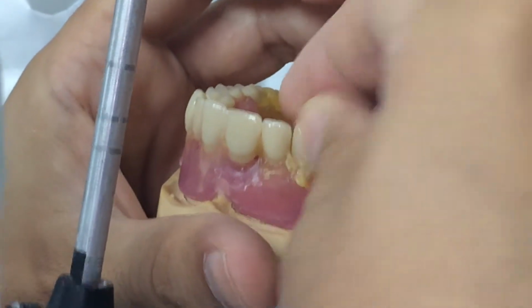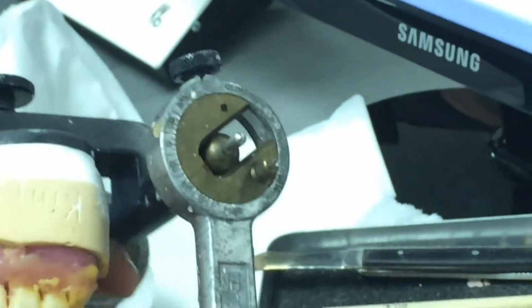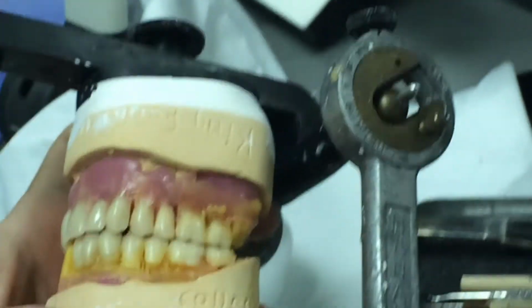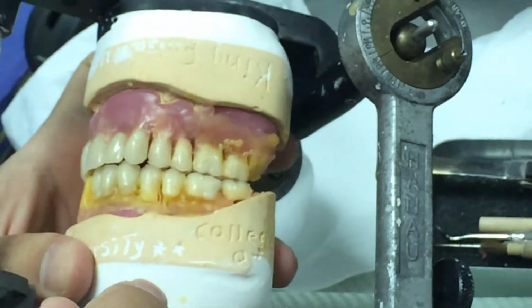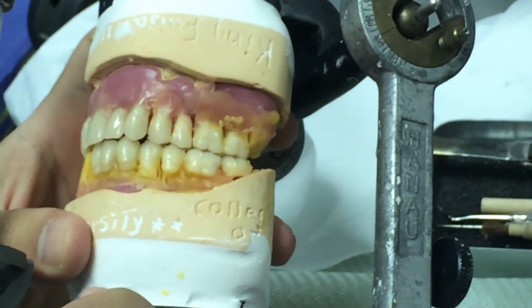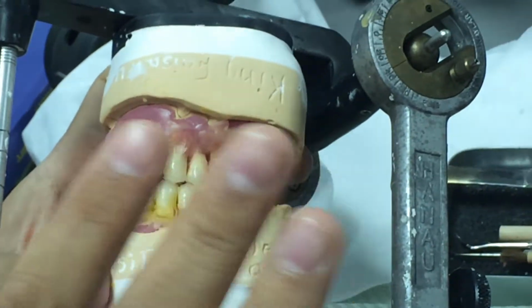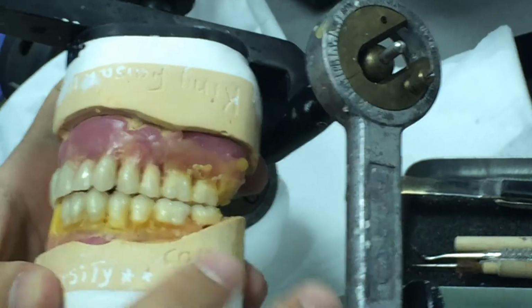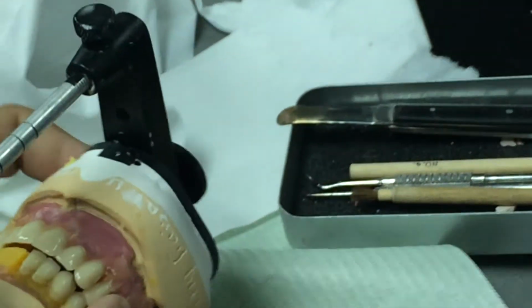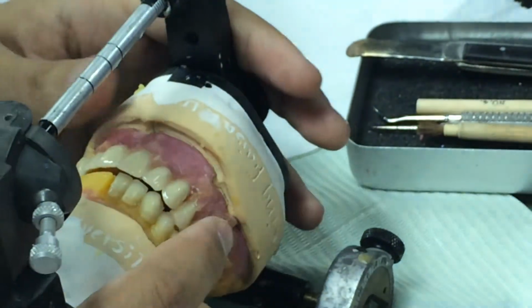Let's say I'm gonna do setting for this posterior tooth, and I cannot do it in occlusion, means there is no enough space. The teeth set is okay, sizes are okay, but there is no enough space for the posterior teeth, let's say one single tooth. خلينا من posterior tooth, anterior teeth.